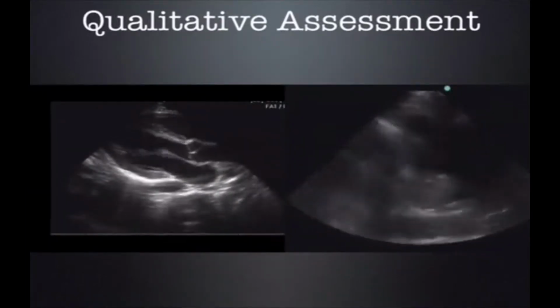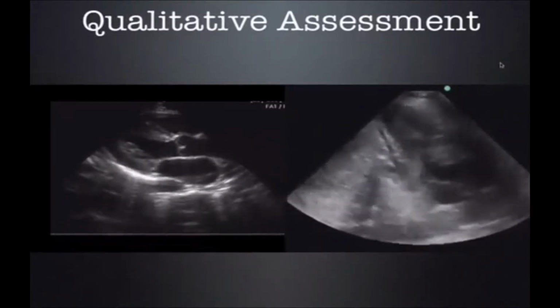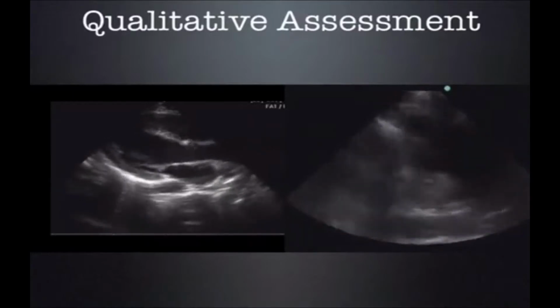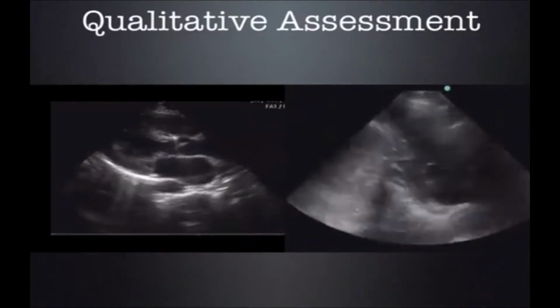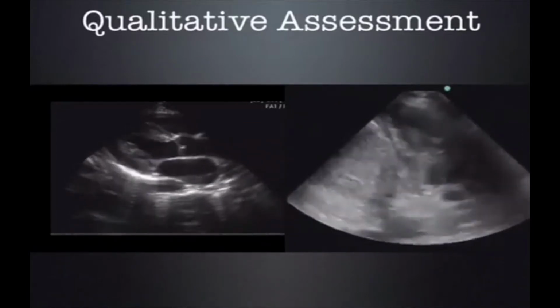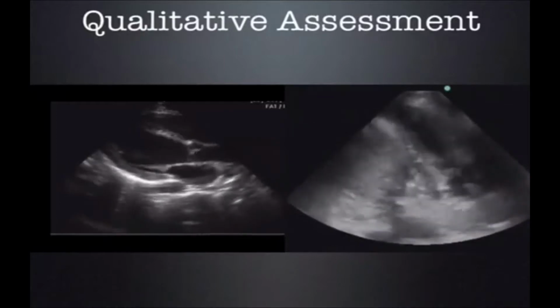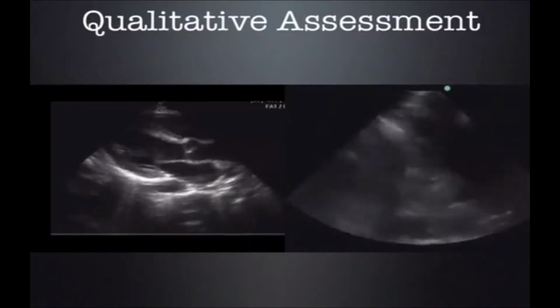So here's a comparison side by side. We have normal, hyperdynamic. Well, why do we care about ejection fraction? In the case of the hyperdynamic LV, as pictured here, this patient clearly needs more preload because their end-diastolic volumes are so low. Now, if this patient has a pulmonary embolus that is obstructing blood flow from the right ventricle to the left ventricle, obviously they need lysis.